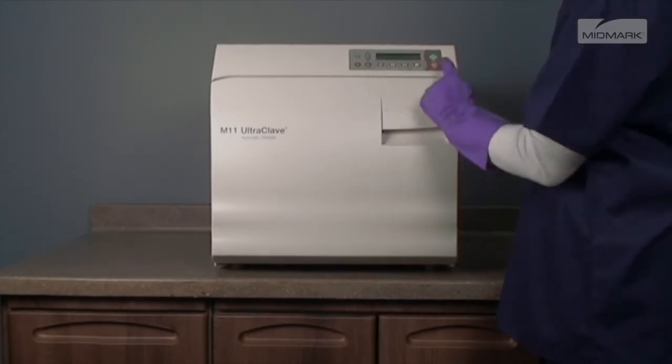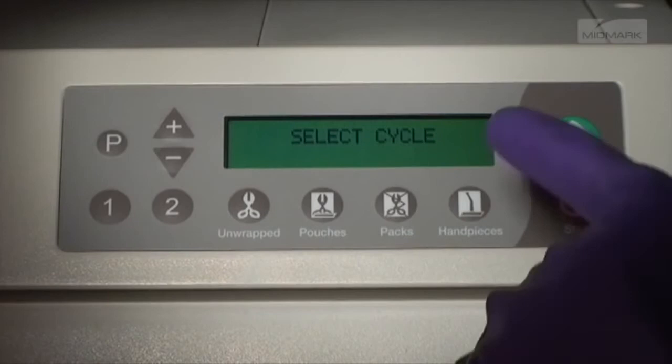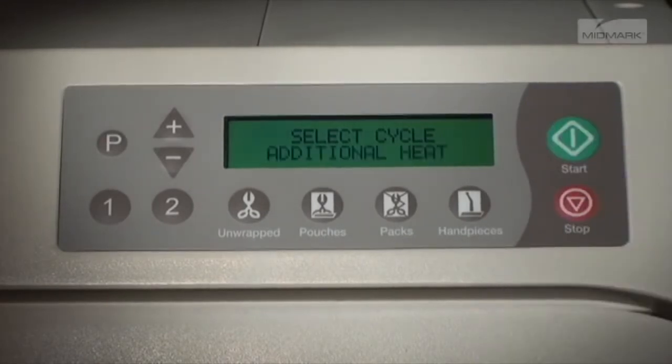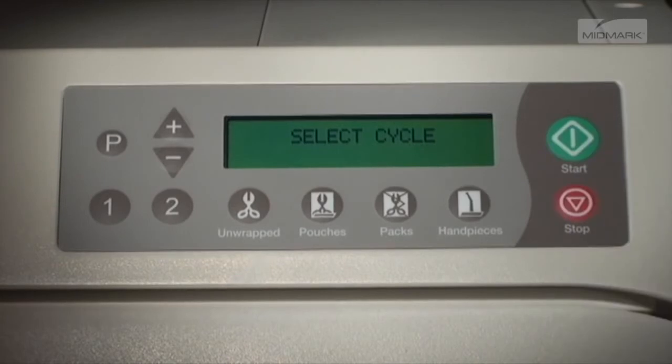The display will show 'Select Cycle' and waits for input from the operator. If the start button is pressed, 'Additional Heat' is shown on the display. This allows the operator to either preheat the unit or extend the drying time on the previous cycle. Pressing the stop button will end the additional heat time.